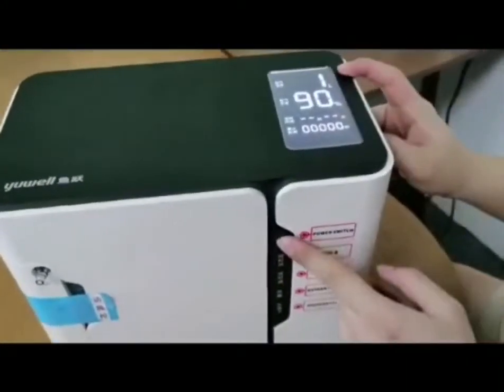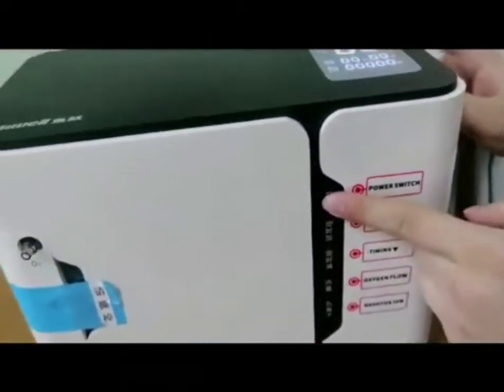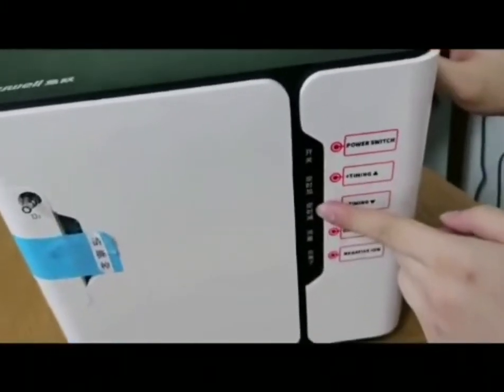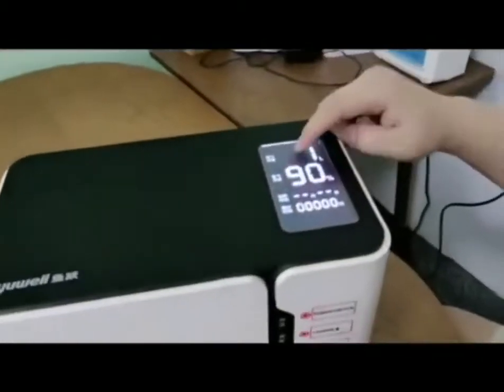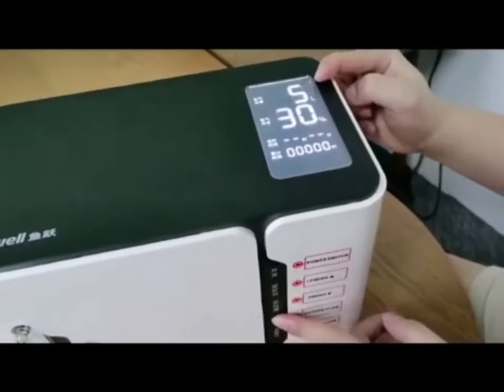The first button is to switch on and off. The second and the third button are for the timing setting. The fourth and the fifth button are for the oxygen flow setting. You can see three liter options.